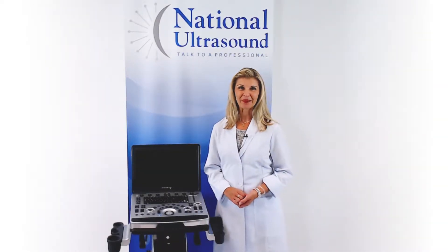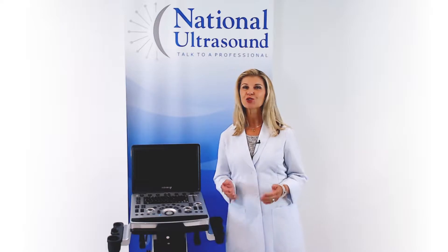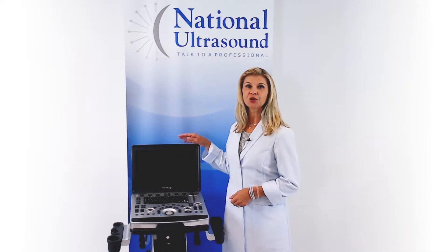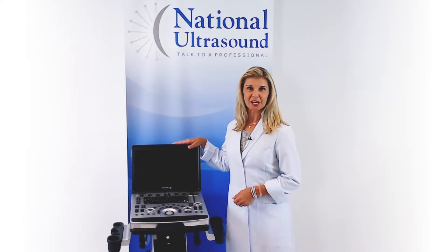Hi, my name is Brandy Benz. I have been a sonographer for over 27 years. Today, I am reviewing the Mindray M8 Elite Color Ultrasound Machine.